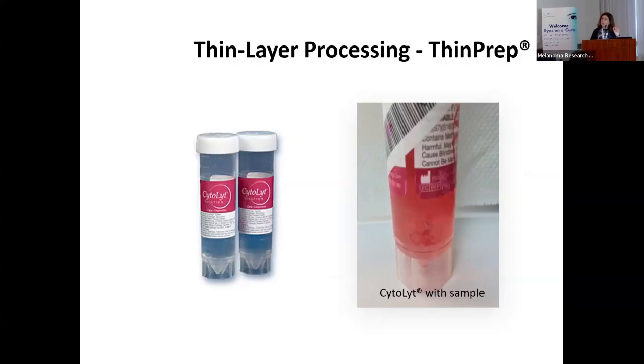So the needle will be rinsed, all the cells collected. The cells are collected in the tip of the needle. The tip of the needle is hollow. So when the needle enters the tumor, cells are shed. Usually we move the needle back and forth a couple times. I'm not sure how often we do that in the eye because we don't want any bleeding or other complications, but the point of the needle is hollow, and cells by shear forces get stuck into that needle, and we rinse all those cells out into a liquid media.